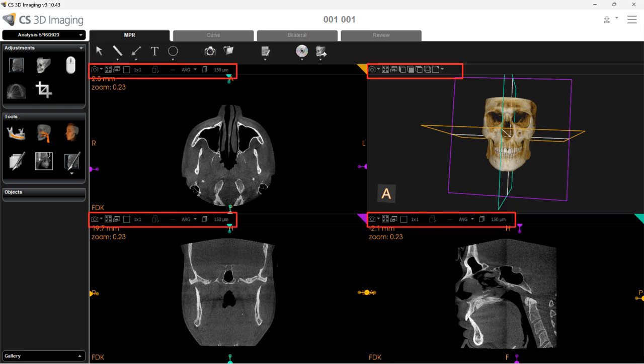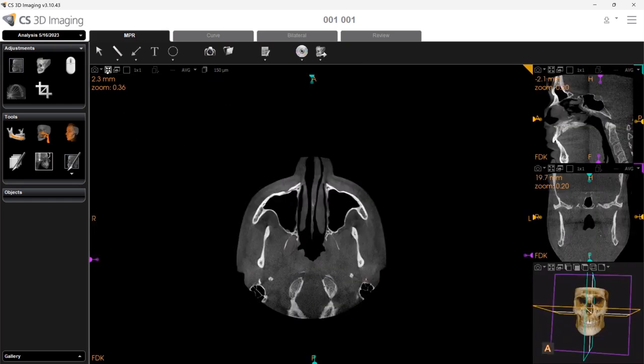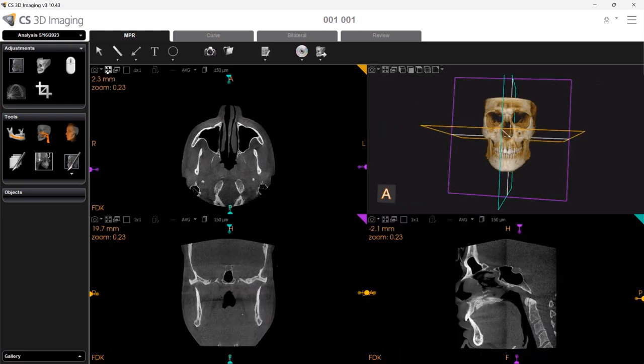The view screen toolbars are available at the top of each view screen, and each toolset is related to the specific image in that view screen. For example, if you would like to maximize one of the views, simply select the Maximize option in the view screen you would like to maximize. Select the same tool to minimize the view screen.